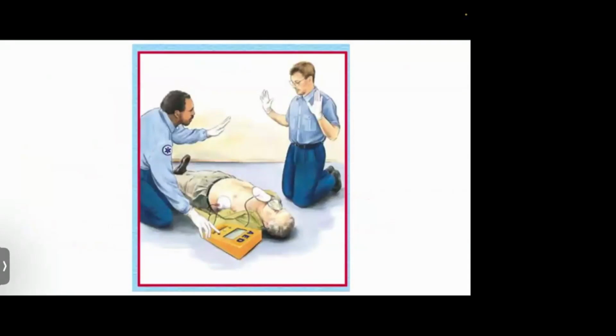So after you've attached the paddles, this is actually depicting the AED, but here also, if you are using standard defibrillation or cardioversion, one thing that is very important is that only the provider of the shock will be holding the paddles. The other people who are there should be away from the patient. Whenever you have the patient, you first of all apply the jelly so that the conductance is good on the paddles.